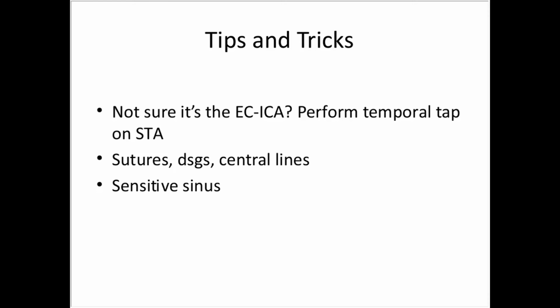And sometimes patients have what's called a sensitive sinus, where if you put light pressure on the carotid artery on the sinus, their heart rate will decrease. Within my 20-some-odd years of experience, unfortunately, I did have one patient go asystole, but as soon as I let off the pressure on his neck, he came back. So you need to keep one eye on your patient.